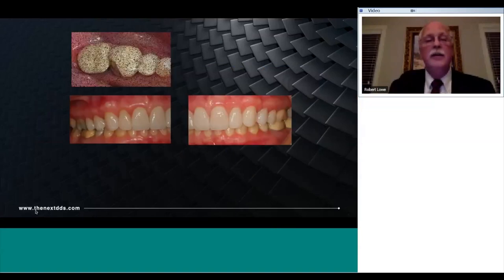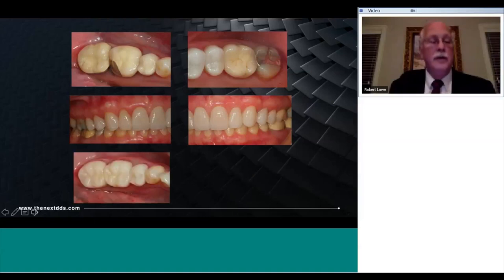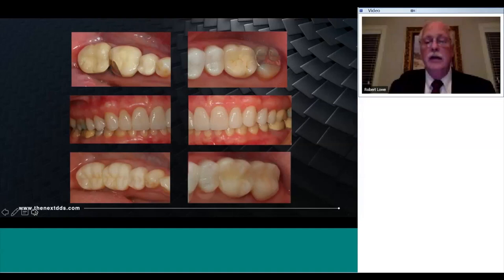Here's a case I did a few years ago. Typical, what happens when a preparation is underprepared and the porcelain is not thick enough? The porcelain fractures. Here are provisional restorations I placed, did a little bit of surgery on the upper, the provisionals after healing.